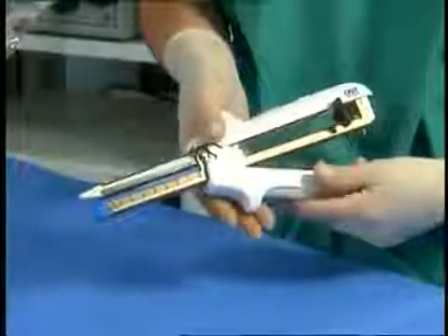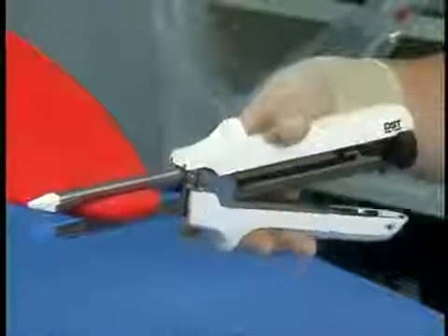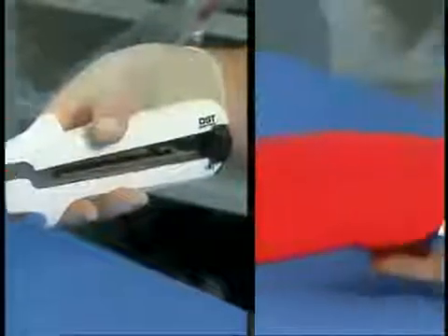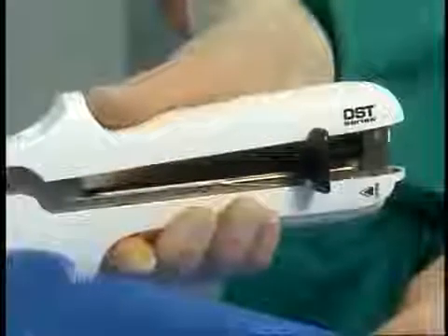Align the forks in a parallel fashion, joining the rear hinges and connecting the front of the instrument as shown. Then close the lock lever — an audible click will indicate that the instrument is closed properly. Remember to verify proper placement of the instrument before firing.